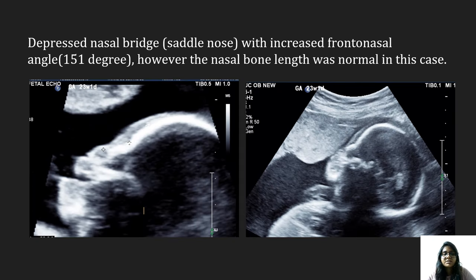Here we can see the depressed nasal bridge, which is known as saddle nose. Saddle nose means collapse of the nasal bridge with decrease in the nasal height. In this case, there was an increased frontonasal angle of 151 degrees. The normal frontonasal angle in 14 to 39 weeks of gestation is 126 plus or minus 7 degrees. However, in this case, the nasal bone length was normal.